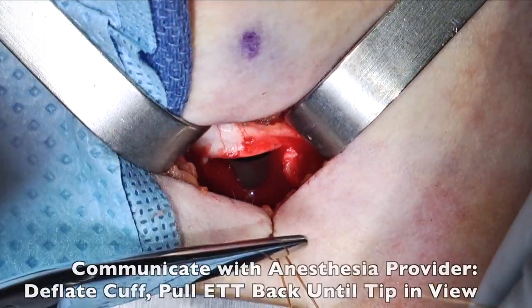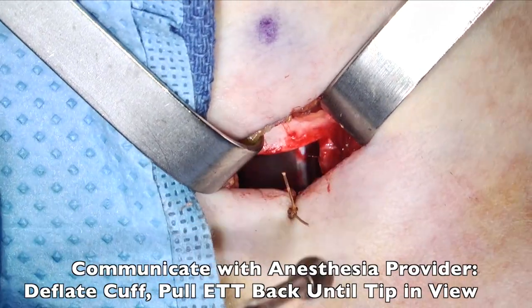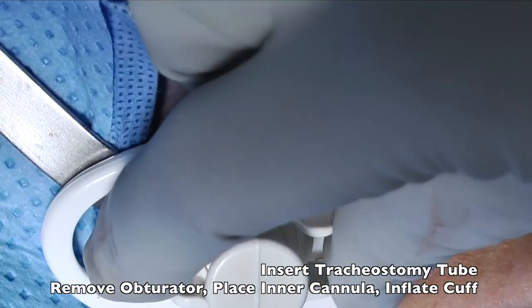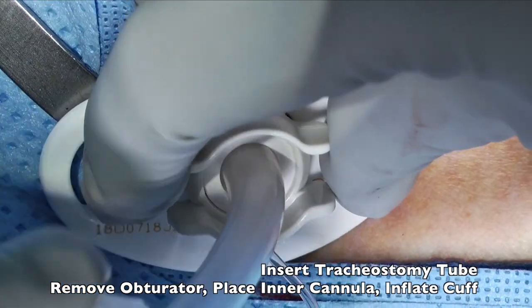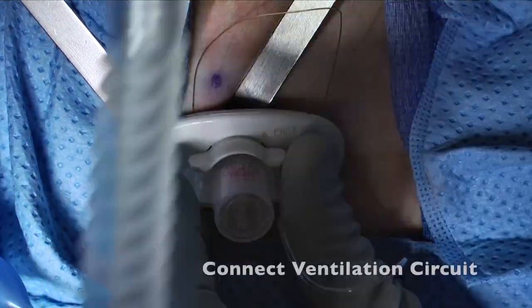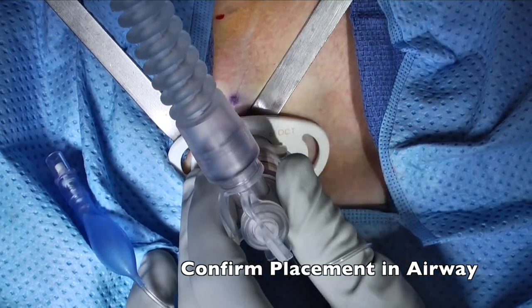At this point, it is once again important to communicate with the anesthesia team in the room. The endotracheal tube is retracted until the tip is visualized, and then the new tracheostomy tube is inserted atraumatically. The obturator is subsequently removed. Then the inner cannula is placed, and the patient is reconnected to the ventilator. It is important at this point to also reinflate the tracheostomy tube cuff. End-tidal CO2 helps confirm that the airway is placed in the trachea.